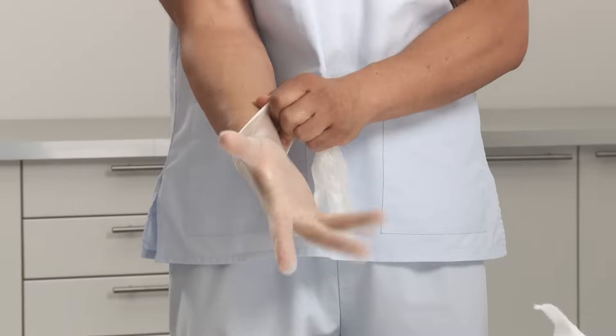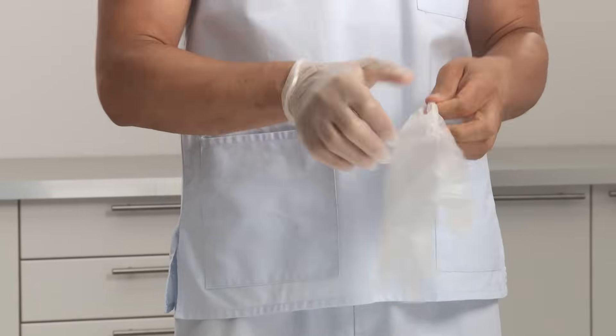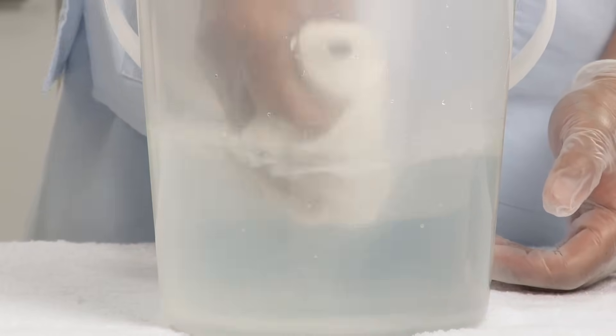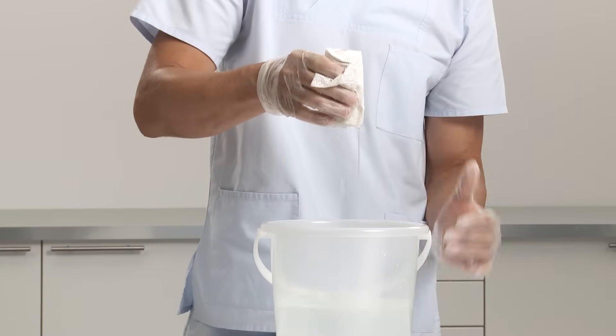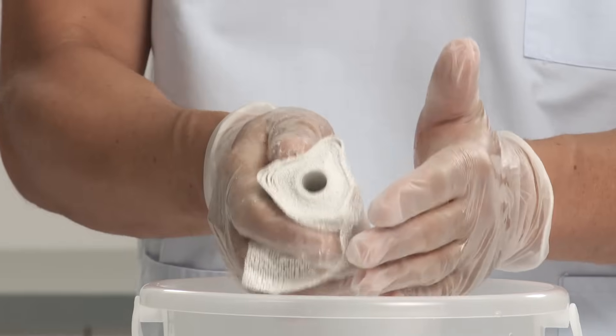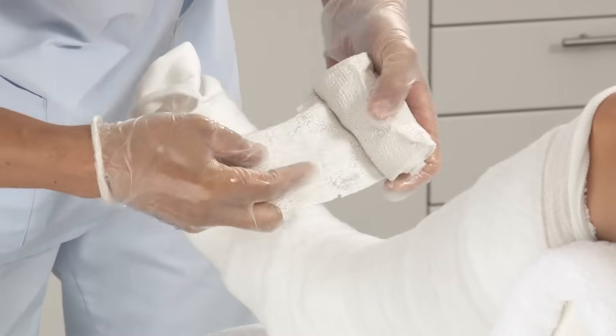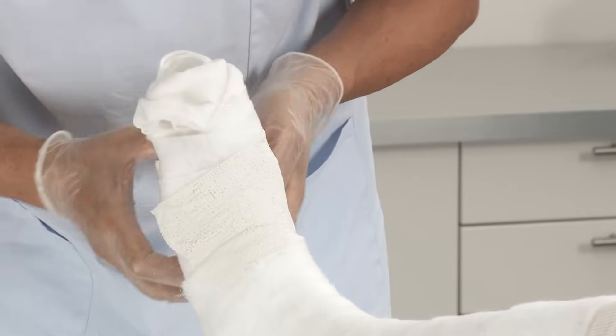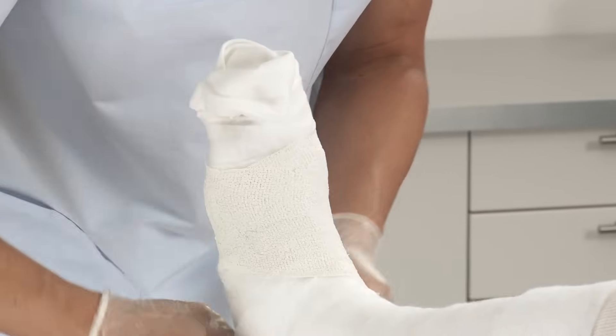It is recommended to wear protective gloves before applying Plaster of Paris. Select the appropriate width of the Plaster of Paris bandage. Activate the bandage by dipping into cool water. Remove from water and gently squeeze to drain. Apply onto the patient's lower leg, starting at the metatarsals, around the ankle and up the lower leg.